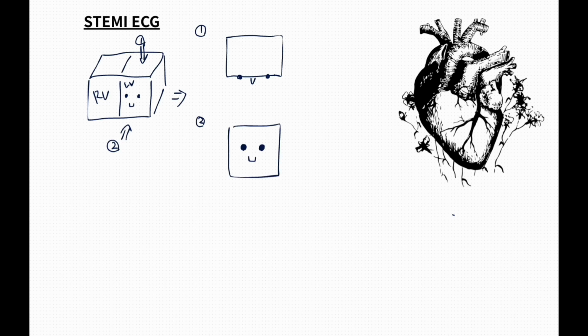Let's map the 12-lead ECG on the schematic. Precordial leads from the anterior perspective: V1, 2, 3, 4 are the anterior wall. V5 and 6 are the lateral wall. V7, 8, 9 are the posterior wall. With this, you can immediately identify which leads correspond to which myocardial area.